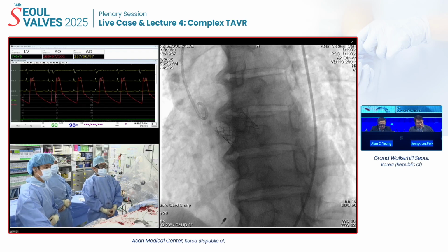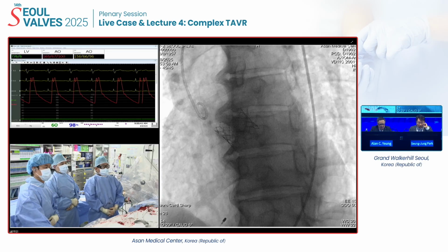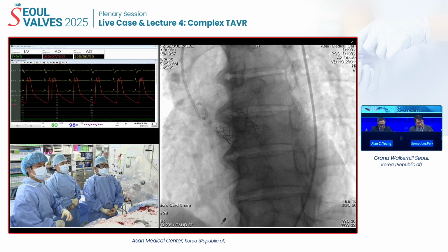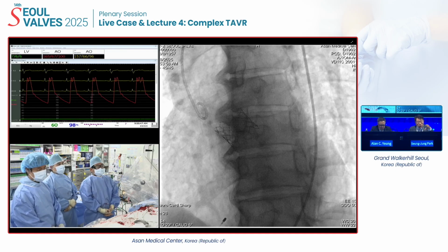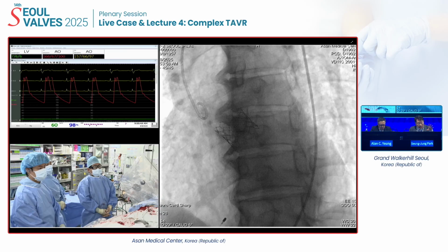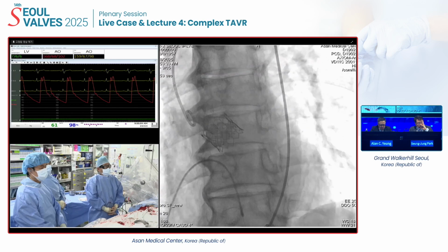Great. Thank you, SJ, and thank you, Alan. In bicuspid anatomy, some have considered a high device position. Is there any difference compared with tricuspid?